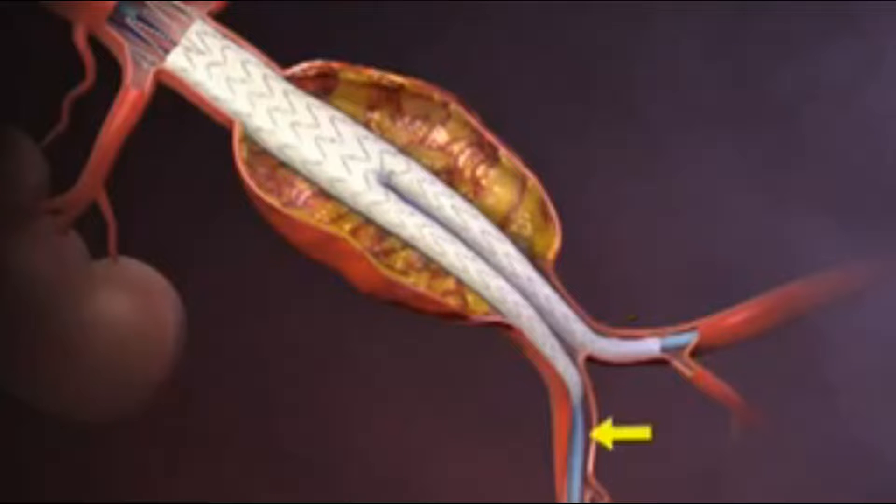The ipsilateral limb of the stent graft is deployed in similar fashion. A balloon is then introduced and used to expand all graft-to-vessel and graft-to-graft junctions in the proximal to distal direction to ensure a tight seal.